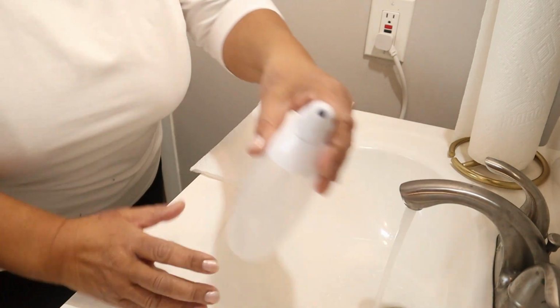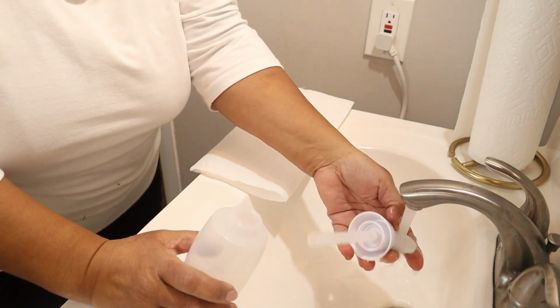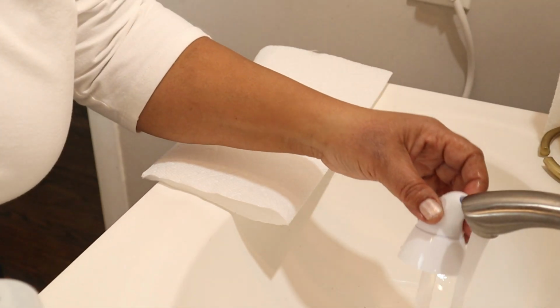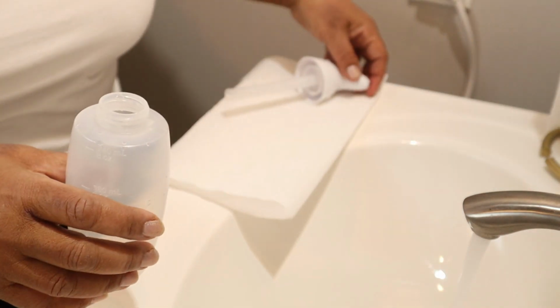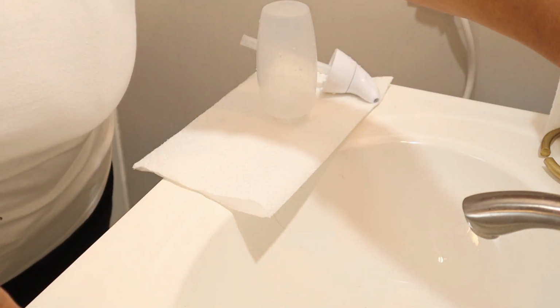You can do that by running hot water over the applicator. You can take it apart and run the hot water into the bottle, and then you can put it on some paper towel and let it air dry until the next use. Now, you may want to check with your doctor before you proceed with these nasal passage rinses. Another word of caution is you would want to change your bottle every 3 to 4 months, depending on how regularly you use it. Just maintain the bottle in a clean, safe area.